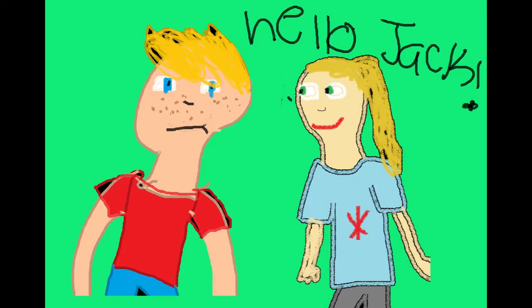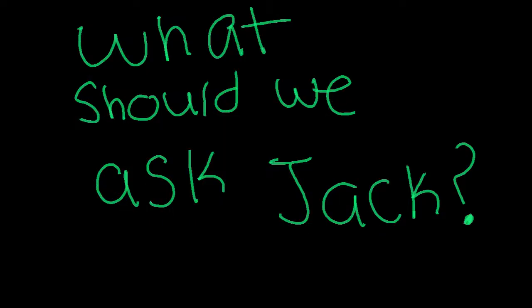Hi, Jack. I'm Danny. I'm one of the EMTs helping you today. What are you doing here? I'm fine. I'm just hungry. Jack, I'm going to ask you a few questions that may sound silly, but they're necessary. Go ahead.